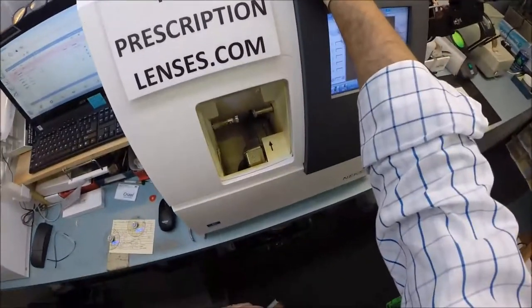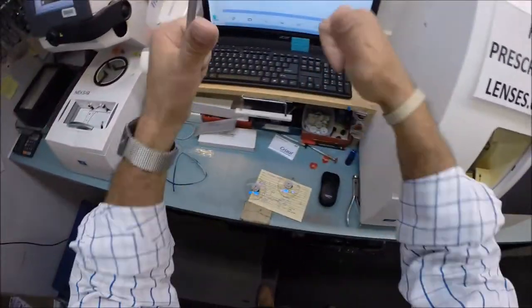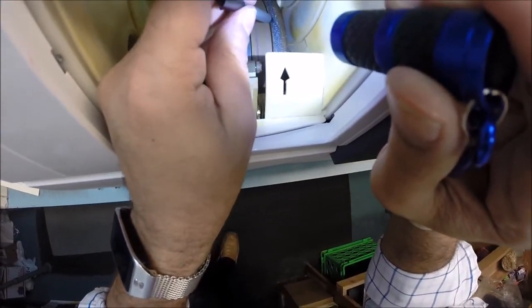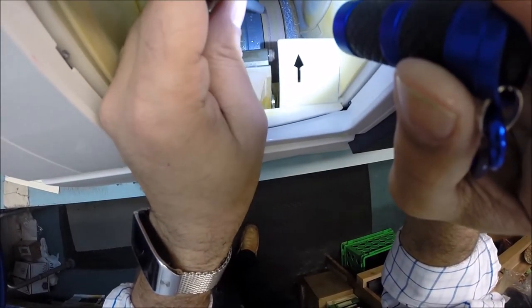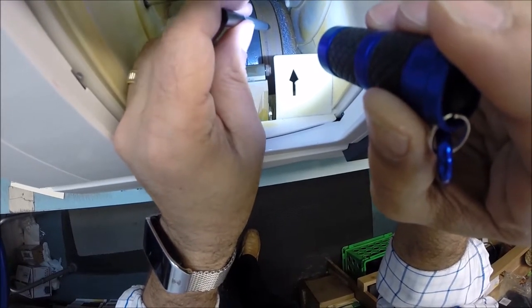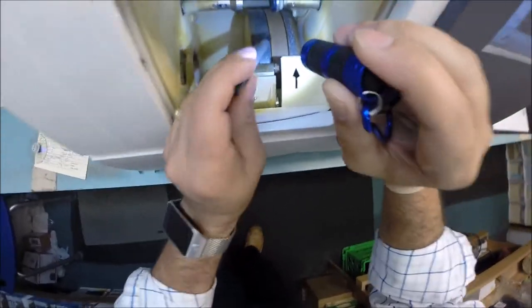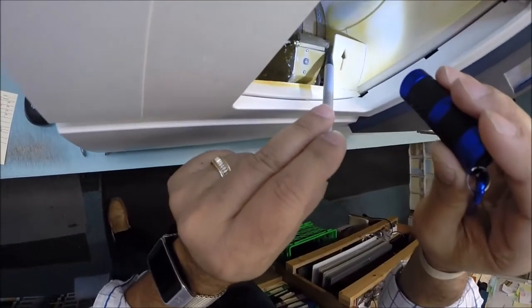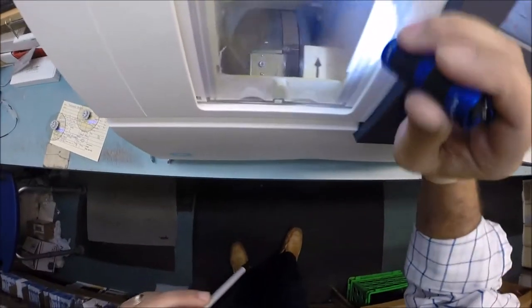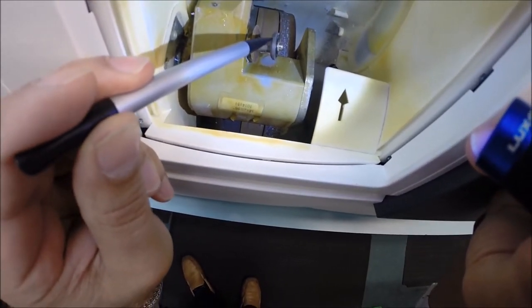This is the edger — this is what's going to do all the work today while I run my mouth. This costs $40,000. The actual cutting wheel on the far right is going to act like a heavy grit sandpaper to grind away the lens material until it's the final size. There's a wheel in the center of the channel that cuts the V-shaped bevel — I will not use that. I'll be using the flat edge side since I'm doing a drill mount. There's a polishing wheel too, but I will not be polishing mine. Underneath here is the drill bit that will drill the holes into the lens, and this is the wheel that will apply the safety bevel to the rear and front surfaces of the lens.